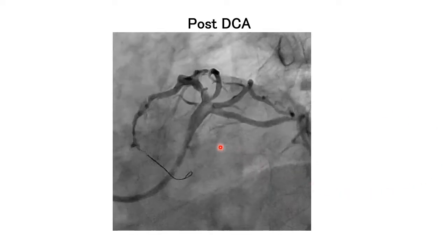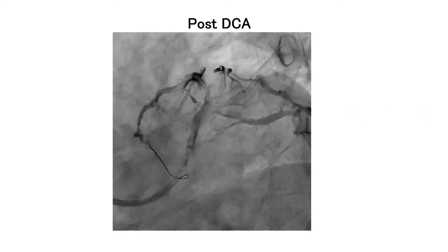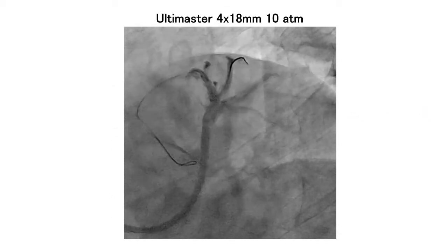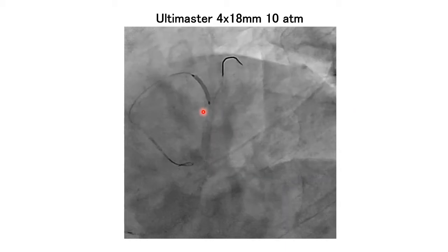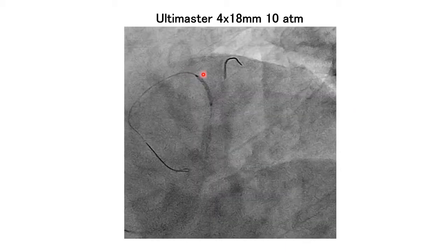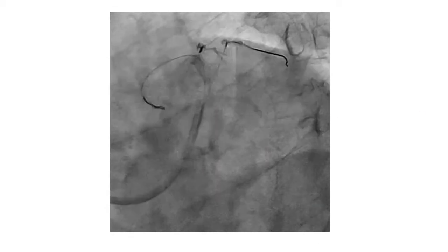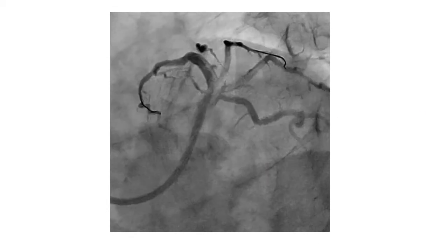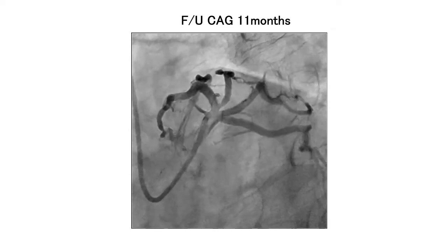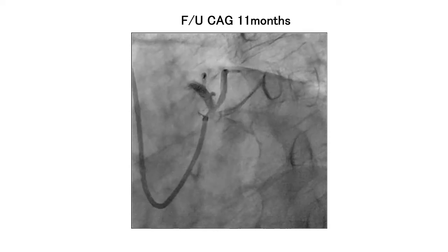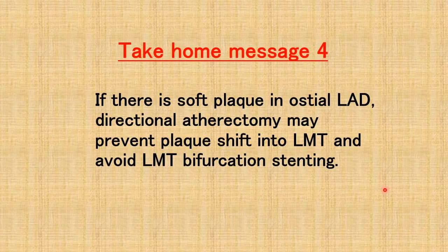The ablation effect looks satisfactory. An Ultimaster 4.0x18 stent was implanted from the orifice of LAD to the distal LAD. Final angiogram shows a beautiful result. Follow-up angiogram shows no restenosis. If there is soft plaque in the ostial LAD, directional atherectomy may prevent plaque shift into LMT and avoid LMT bifurcation stenting.